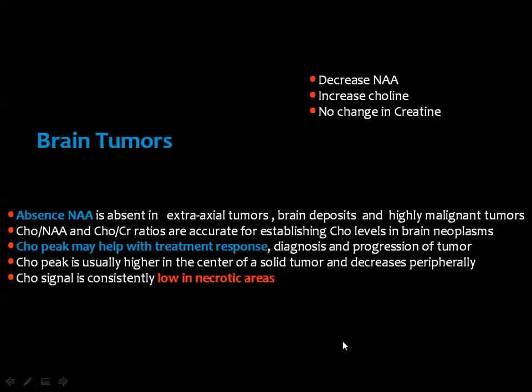The major findings in MR spectroscopy of most brain tumors are a decrease in N-acetyl aspartate, an increase in choline, and no change in creatine.